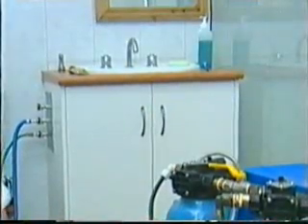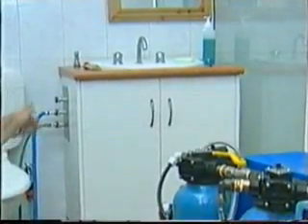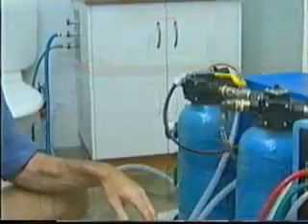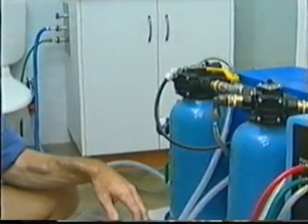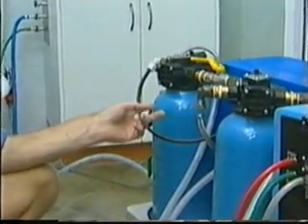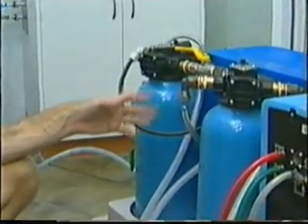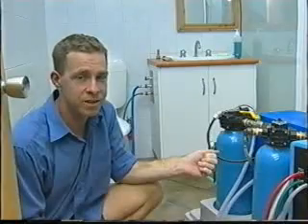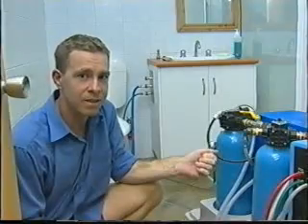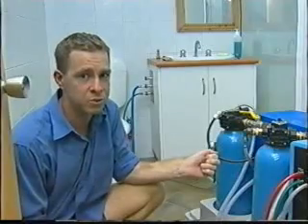To remove the rubbish in the blood, one thing a kidney machine needs is very clean water, not too hot and not too cold. A special filter box called an RO unit does this. Here is Mr. Harding talking about his RO unit. This is the RO unit. It cleans the water as it comes into the dialysis machine, and the plug at the back is where the wastewater goes out, and it goes out into the normal sewage pipes.